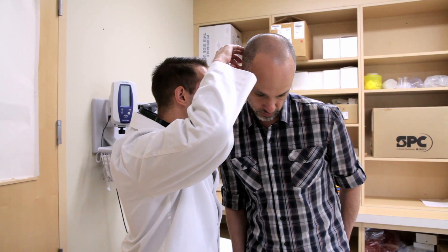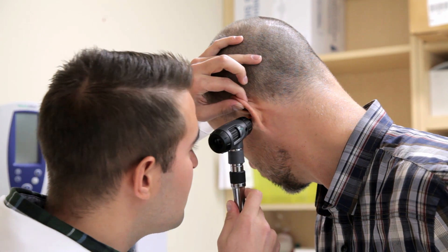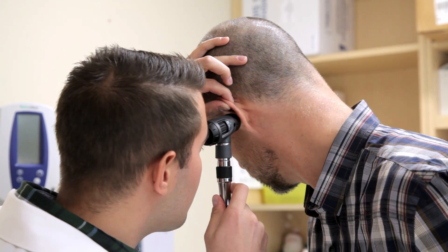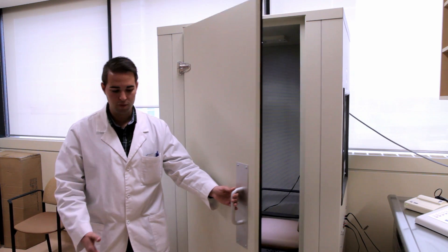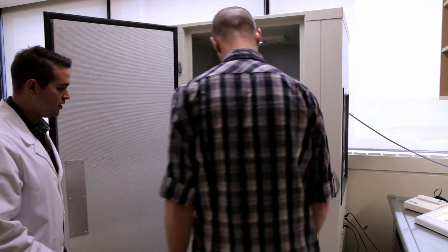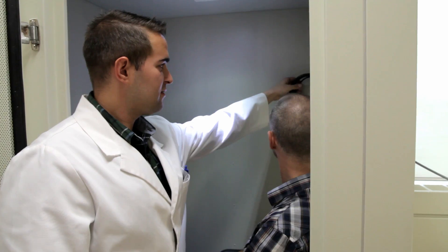First, individuals will complete a hearing surveillance questionnaire to uncover any history of hearing abnormalities or any conditions that may have an impact on testing. Second, an otoscopic ear examination of the outer and middle ear structures is performed in order to identify any abnormalities that may impede the ability to hear pure tone sounds.